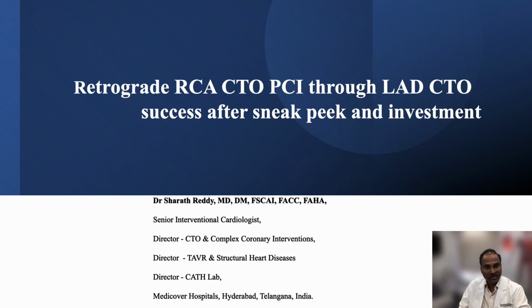In this, I'm bringing a case of Retrograde RCA CTO PCI through LAD CTO, and success after a failure.